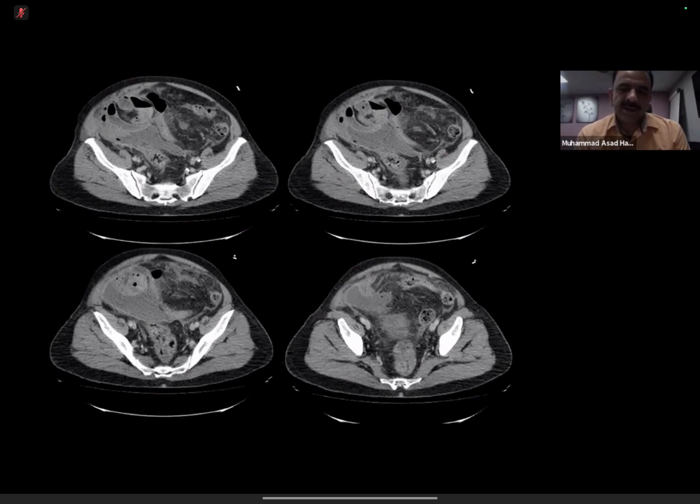Good. This one is fairly large, as you rightly said, and it is amenable to percutaneous drainage. But at times, these collections can be fairly deep in the pelvis, and they may not be amenable to direct access or easily accessible. However, one of the previous candidates has given us feedback that some examiners are looking for the Hinchey classification of such drainages.